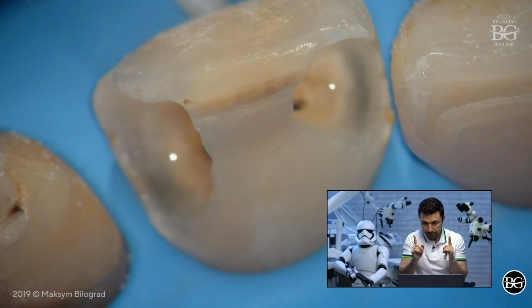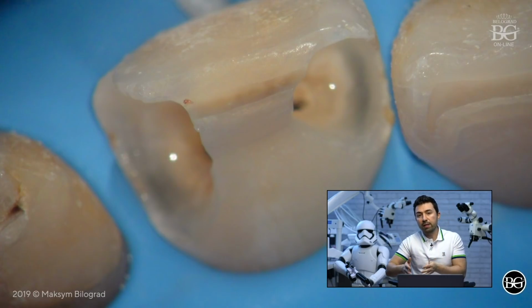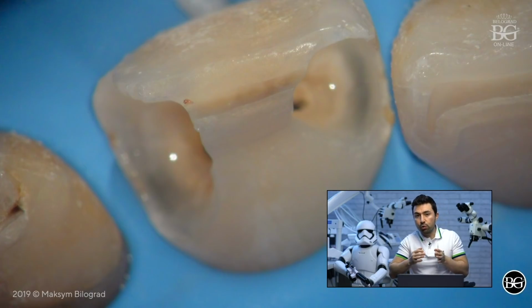But we can do this type of access if it is not in the way of providing proper endodontic treatment. In other words, endodontic access has to be as big as you need for root canal shaping, root canal irrigation, and root canal obturation. Okay, so these are the steps of endodontic treatment.